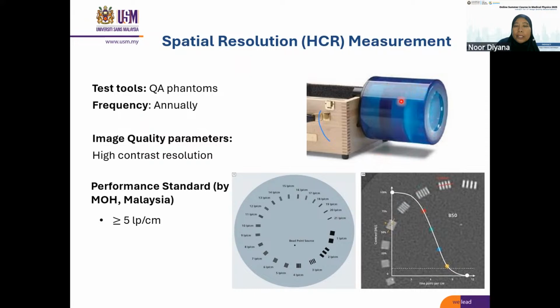Okay, for example, here it is a CATphan. In my center, we usually use the CATphan for our routine QA. So the positioning of the phantom also plays an important role. If you don't properly position your phantom, you won't get a good image, and it will affect your assessment.